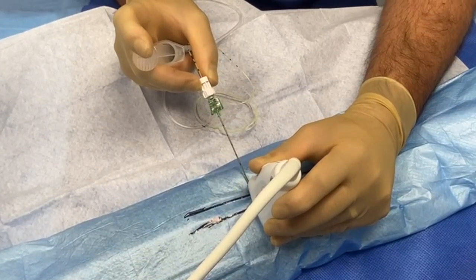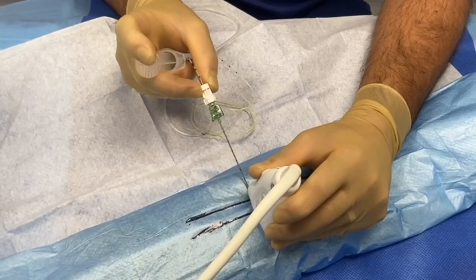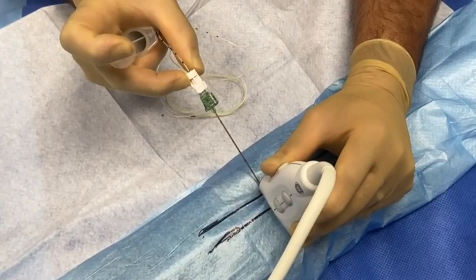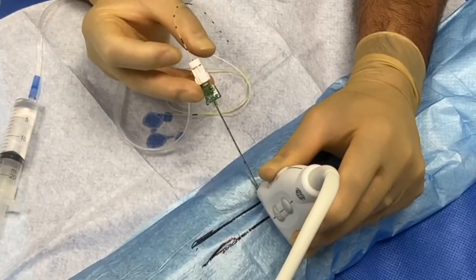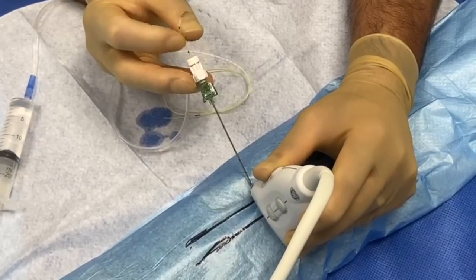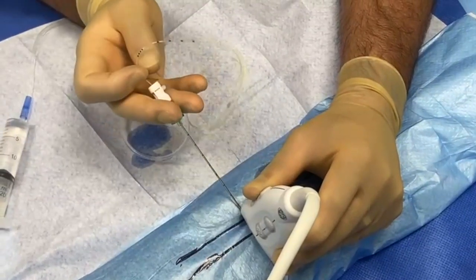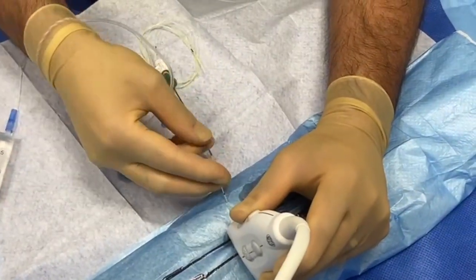In this setup we're mimicking a patient in the prone or lateral position doing the needle in-plane, as if doing a standard single-shot block. Once you've passed the common peroneal nerve and you're in the sheath, inject local anaesthetic to open up that sheath. Then put the syringe down, hold on to the needle, and because your catheter is already pre-loaded, advance the catheter in-plane. In an ideal manner you produce the buckle technique — keep threading until you see it go forward and buckle back on itself. Then simply remove the needle while ensuring the catheter doesn't move, grasping the catheter at the site and bringing the needle out without dislodging it.